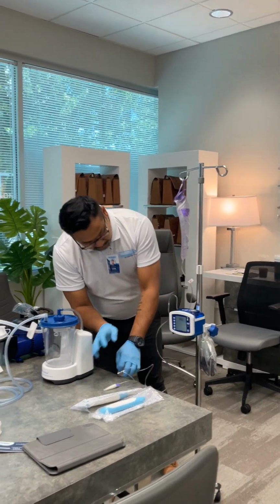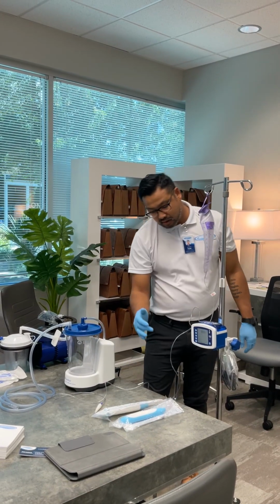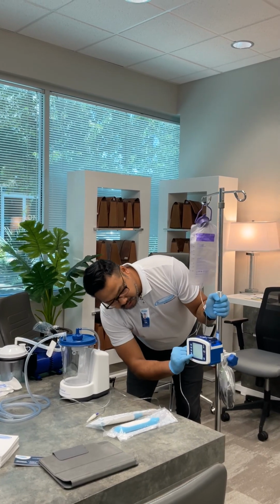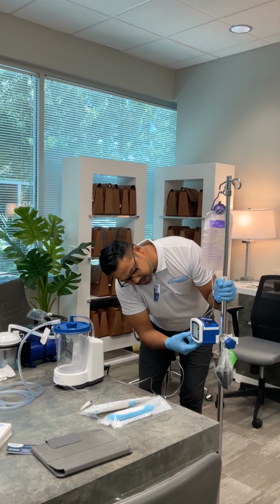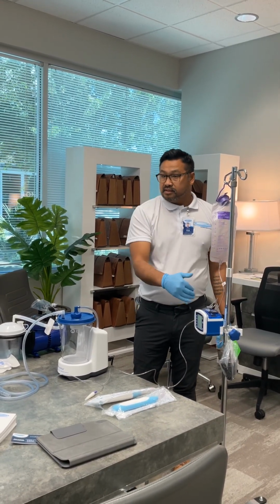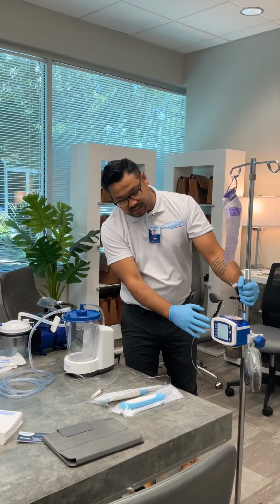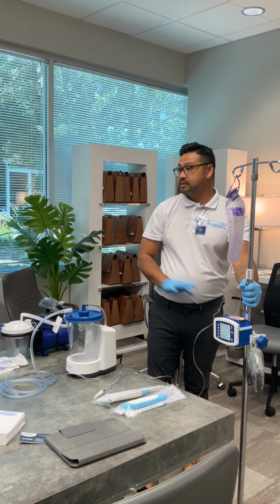But other than that, once it's all set to your desired prescription, all you have to do is press the run button and it'll start doing it. See right here on the bottom, second to the bottom menu, you press run, it'll start running, and then it'll stop at the desired number of the feed rate. Okay, that's all that is. Very, very simple. Once it's set, all you've got to do is power it on, power it off, add formula, or change the bags. That's it.